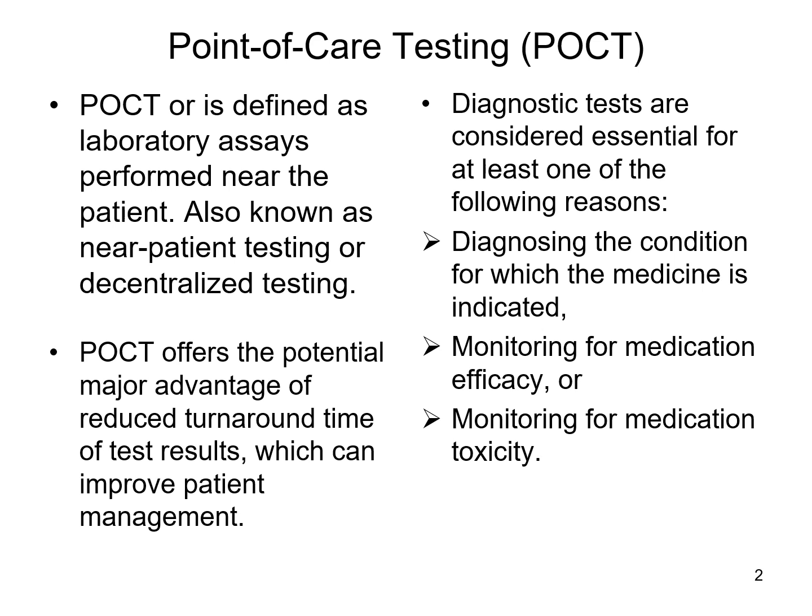So a lot of times, or even something like glucose monitoring, to decide if a patient needs insulin or maybe that they need some kind of glucagon bag or tablets or something like that. So it can monitor the patient at bedside, and you don't have to wait for that sample to go to the lab and be spun down and processed and run on those analyzers, which can take time. So by doing the testing at bedside, you can get results within a few minutes.